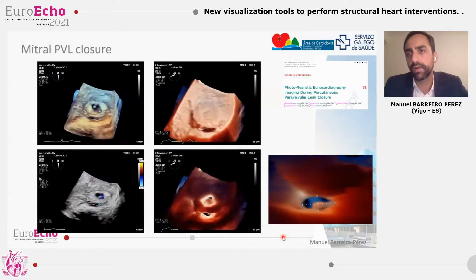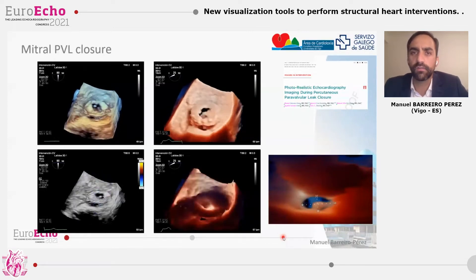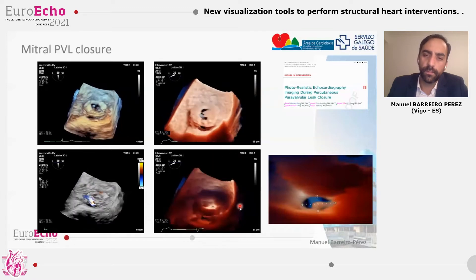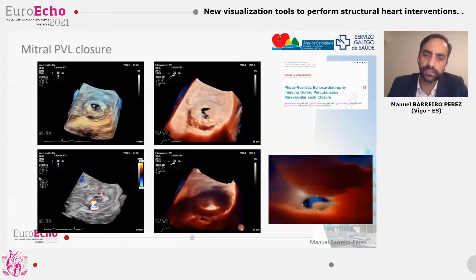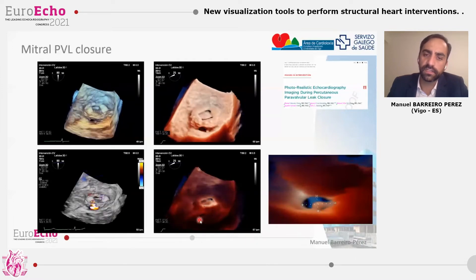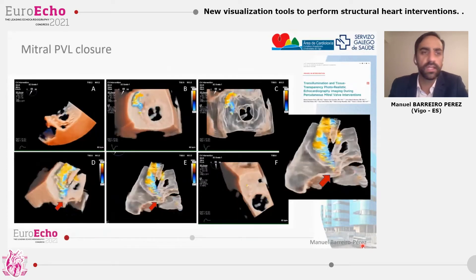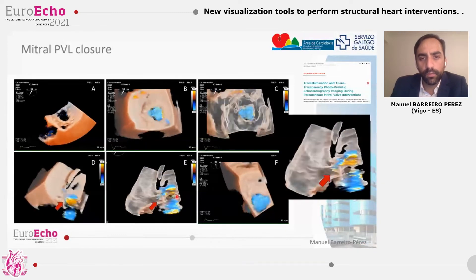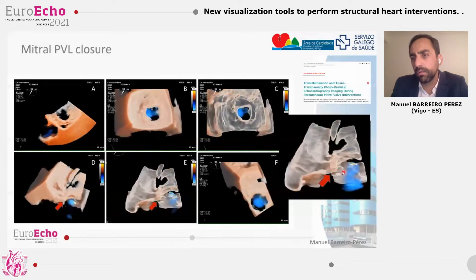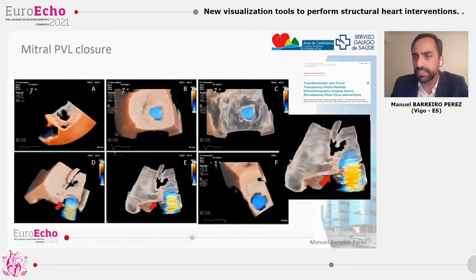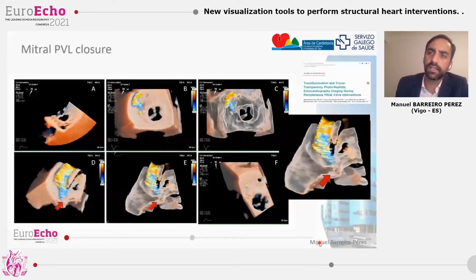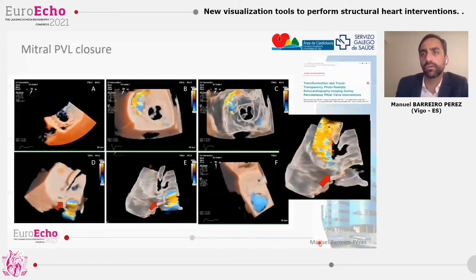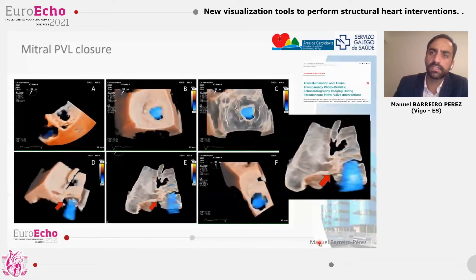For the mitral paravalvular leak closure, we could study and perform these procedures with classical renders, especially employing 3D color. But if we employ the true view with transillumination, placing the light behind the prosthesis, the light flows through the defect and it's really clear where the defect is, what the shape is, and what the measures are for selecting the device to close the defect. Employing the glass view with transparency, we could see the wall path and the tunnel of the residual paravalvular leak, and we could select a better strategy and device for our best approach to close the defect, making a distinction between linear tunnels and truly tortuous tunnels.